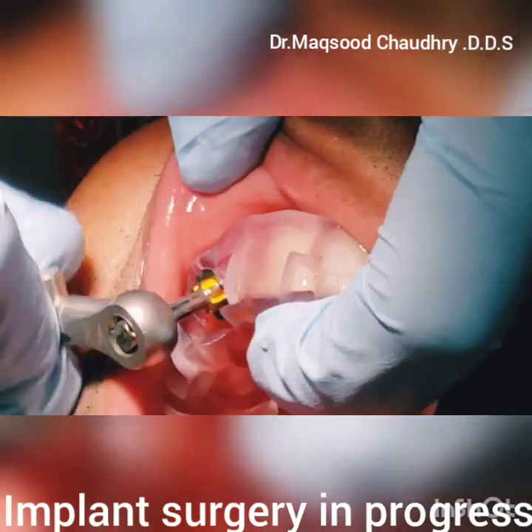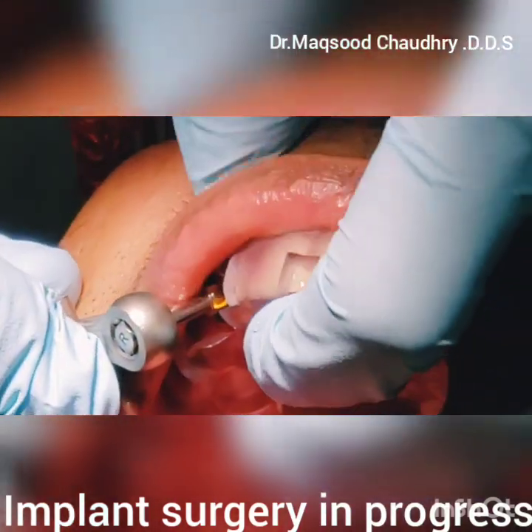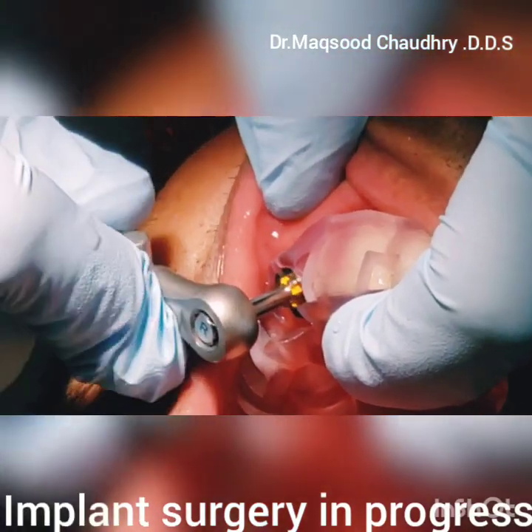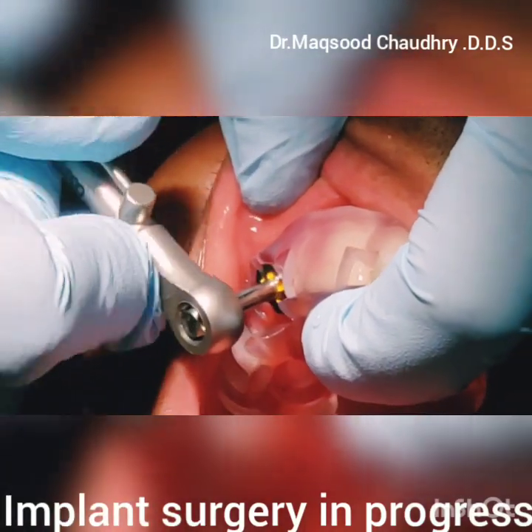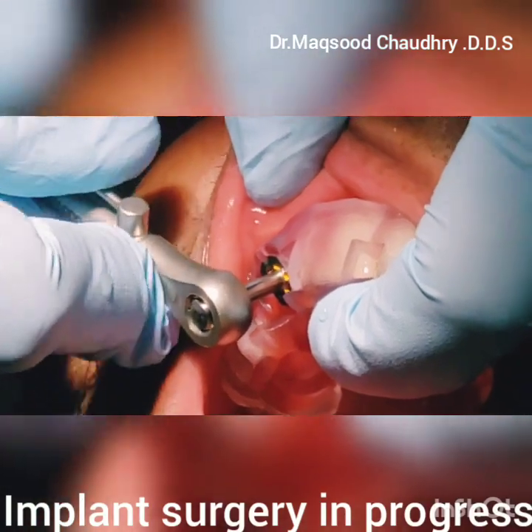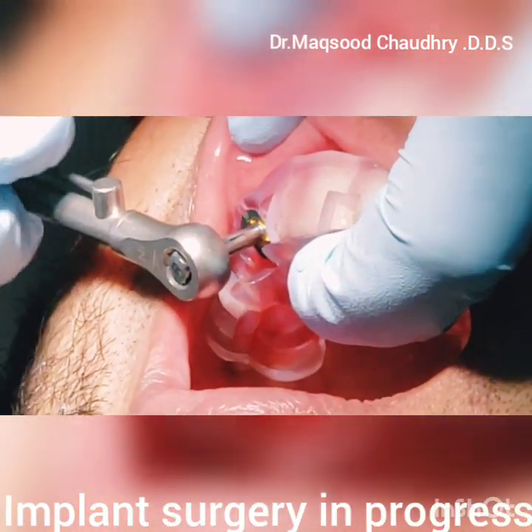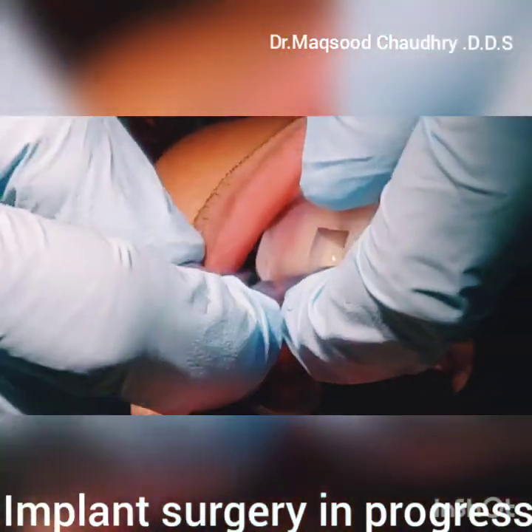It's almost in. These yellow spots on the drill show us how much more it needs to go in. We still have our surgical guide in. It's pretty stable, more than 40 Newton centimeters of pressure.